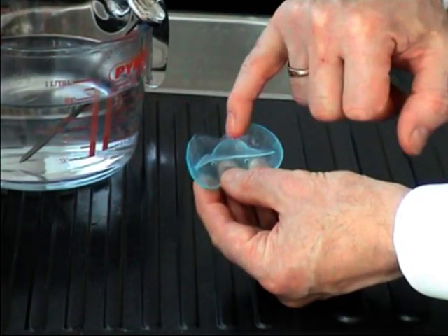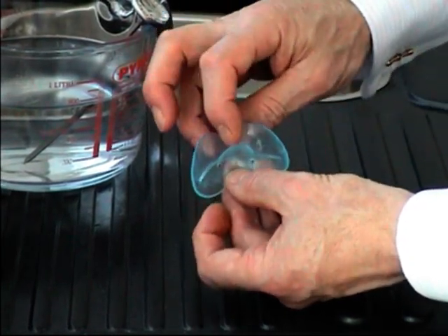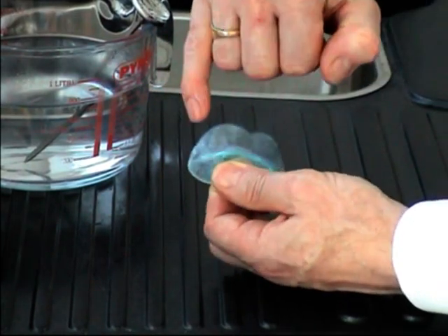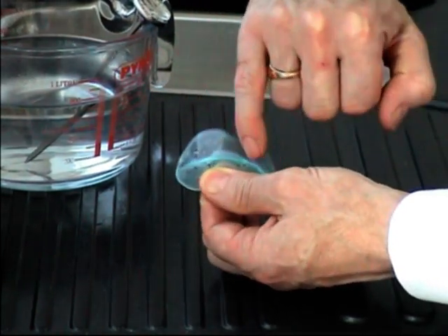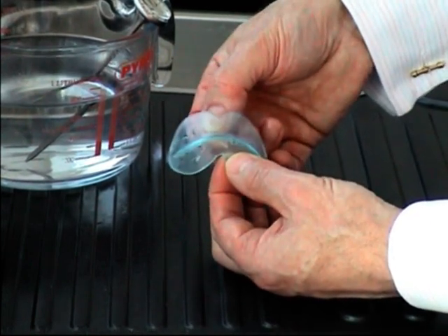You can see that the tab on the inside is now facing upwards — that goes behind my teeth to anchor the device. And there are some impressions of my teeth in the plastic. You can also see how much smaller it is now than when it first started.